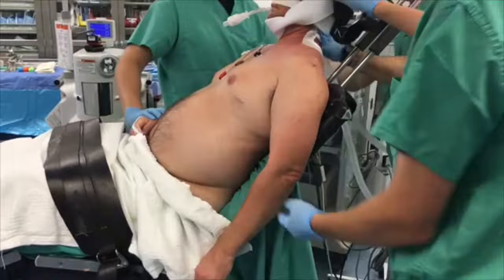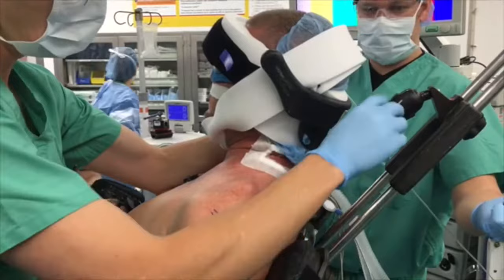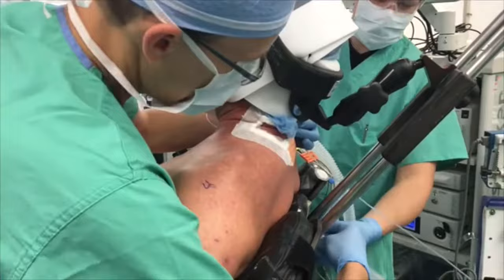Once the patient is sitting up, the head positioner must be readjusted to assure their neck is in the neutral position. Again, care must be taken to make sure you completely lock the head positioner.